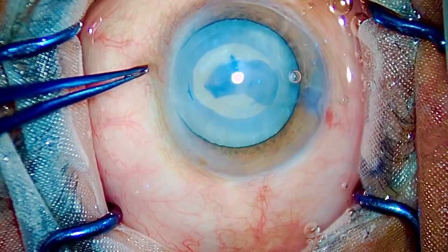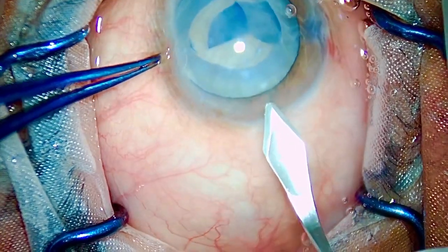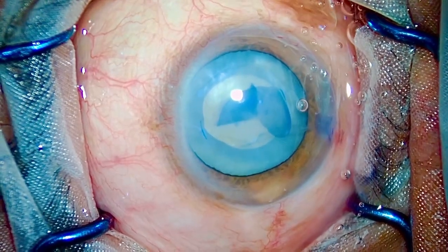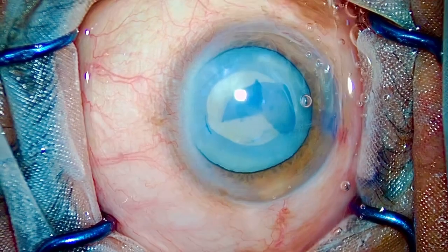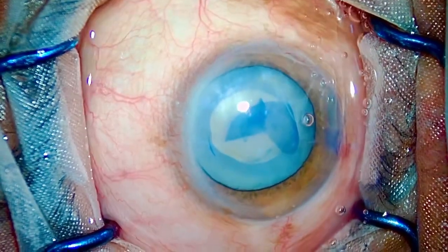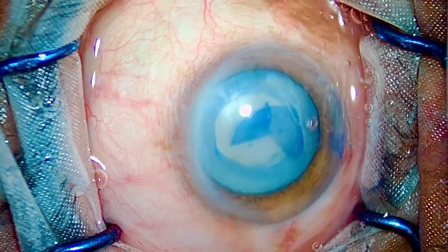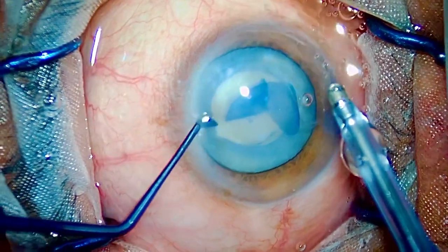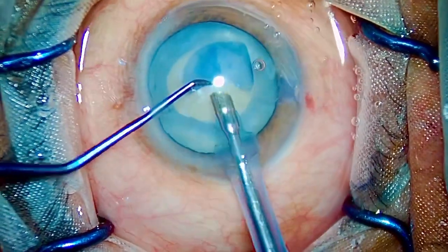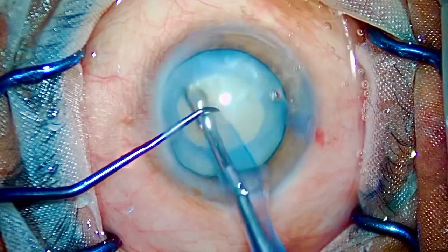As I have completed this Rexes, tip number two — the golden tip from this video: never, ever attempt hydrodissection in cases like these. Back in my training days, in one such case I did hydrodissection and the bag split open, the anterior capsule ripped apart and I had nowhere to go. Ultimately I had to put a sulcus IOL in the patient. He is doing well, but never do hydrodissection in these cases. As you can see in the video, I have directly put some Visco and started the FACO.